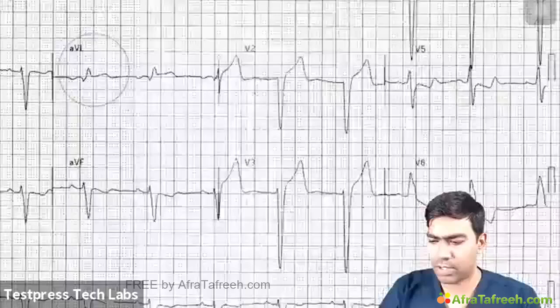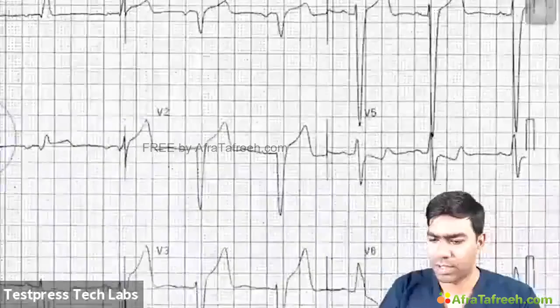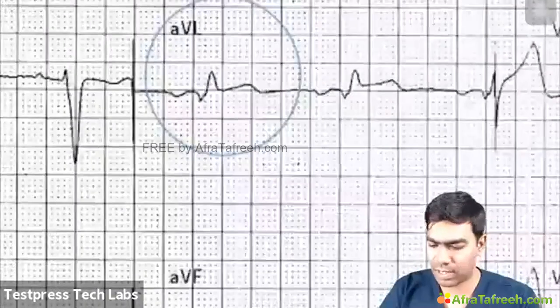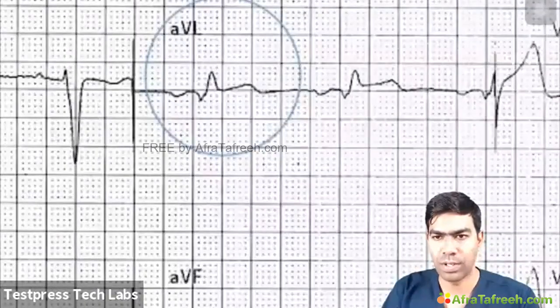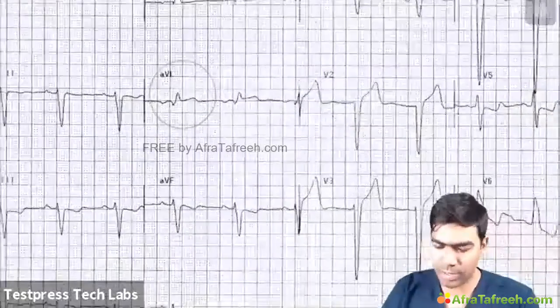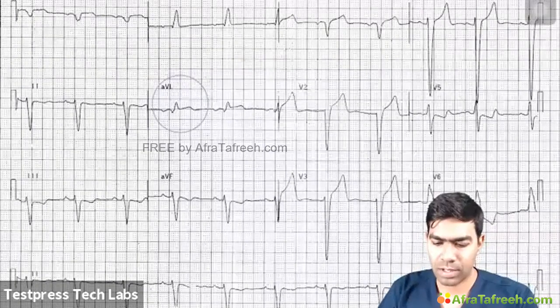So now you can understand. So here the Sgarbossa criteria is not really positive. And in lead V1, not so good. And as far as the AVL is concerned, it's a definite Sgarbossa positive. As I told you, extreme discordance, I'll show you a different one. No, it's not extreme discordance. I don't think so. Yeah, only 3 millimeters there. There's no extreme discordance, but this is a concordance.